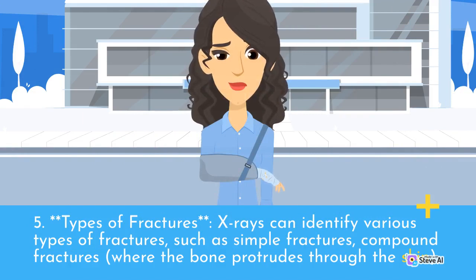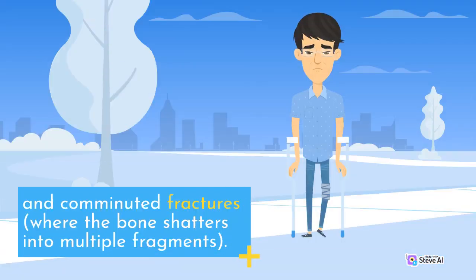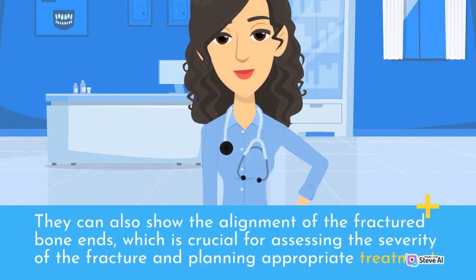5. Types of fractures. X-rays can identify various types of fractures, such as simple fractures, compound fractures, where the bone protrudes through the skin, and comminuted fractures, where the bone shatters into multiple fragments. They can also show the alignment of the fractured bone ends, which is crucial for assessing the severity of the fracture and planning appropriate treatment.